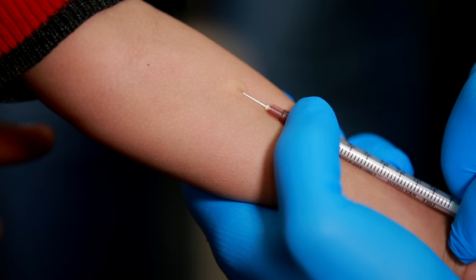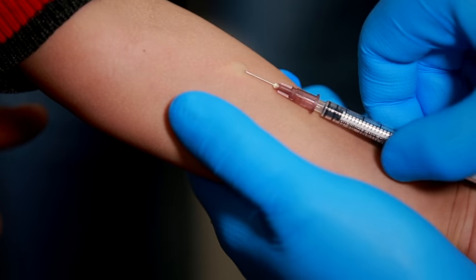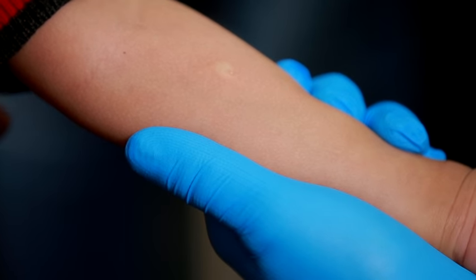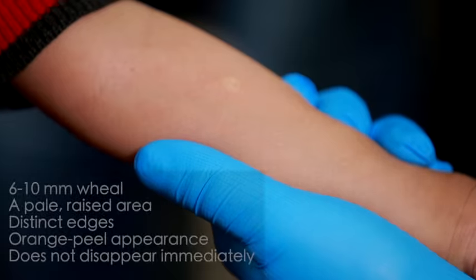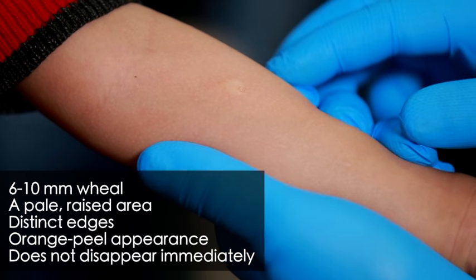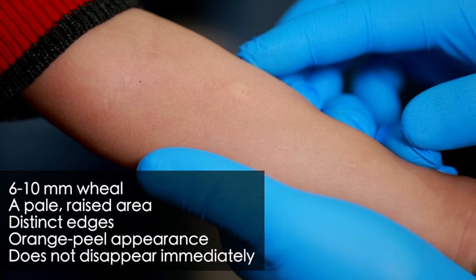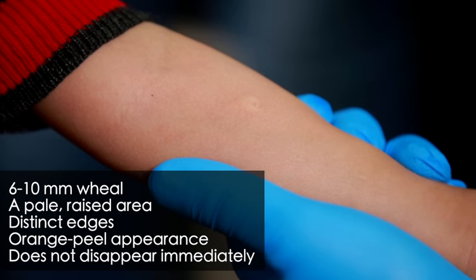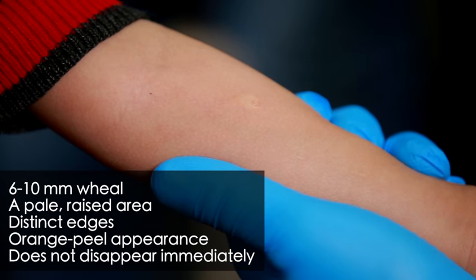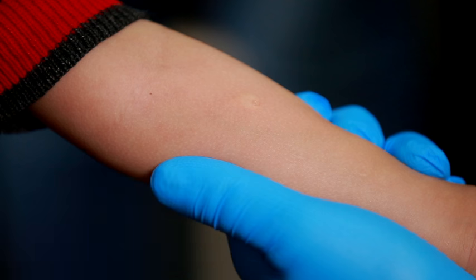Inject the antigen into the superficial layers of the skin on the volar surface of the forearm. A 6–10 mm wheal is formed, which is a pale, raised area with distinct edges, having an orange peel appearance, and does not disappear immediately.